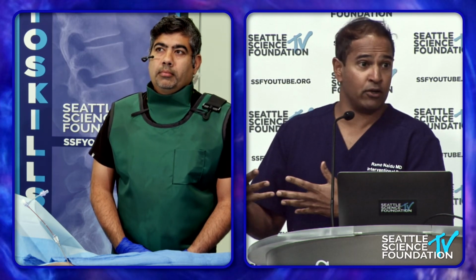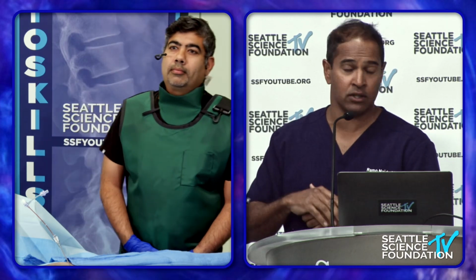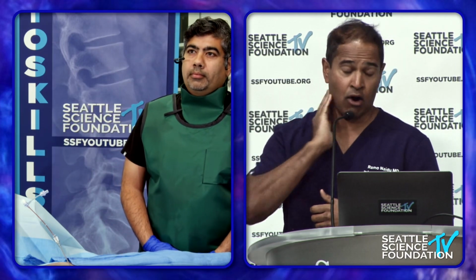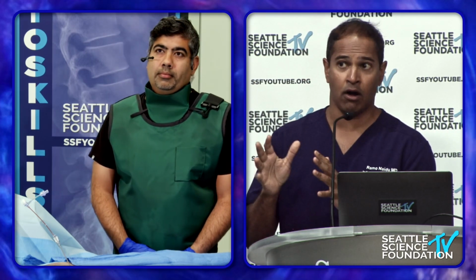So if they have severe spinal stenosis at the level you want to go at, that's probably not a good situation. You may have to do spinal cord stimulation. Or if you're dealing with an arm issue and you want to do a C5 DRG, that might be a little risky, starting off. That's off-label, in which case you'd probably choose dorsal column or spinal cord stimulation.